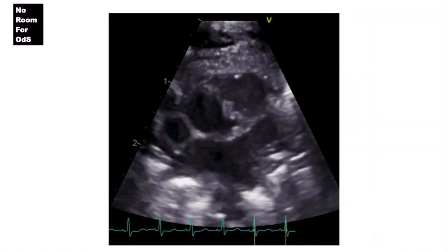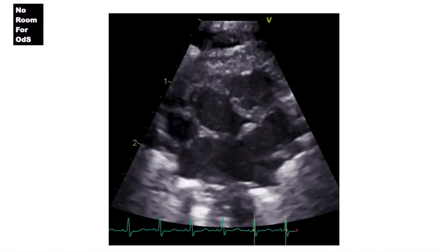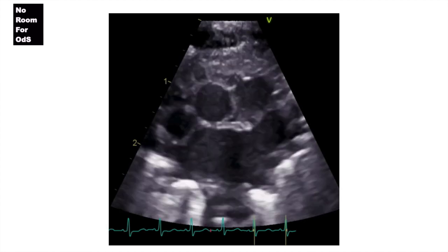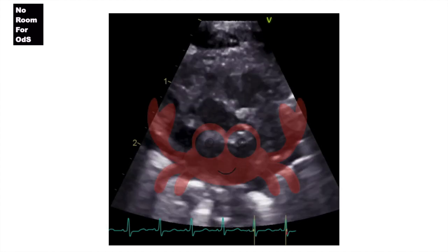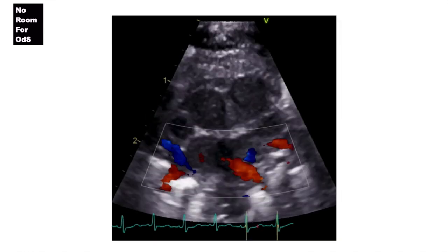This is the image that you get. And if you're wondering why it's called crab view, well, you just have to give it a little bit of imagination — and there you go.